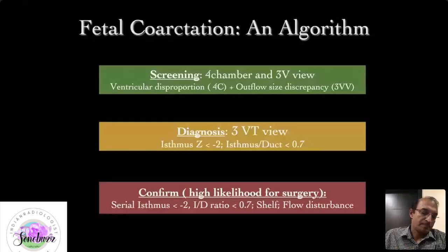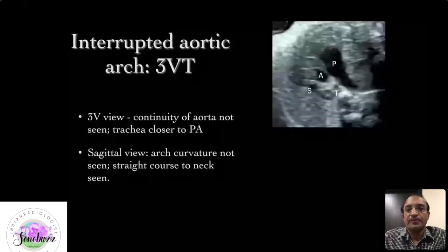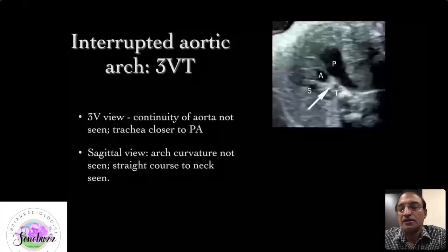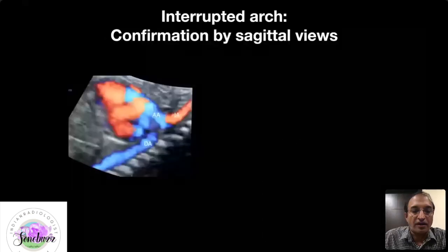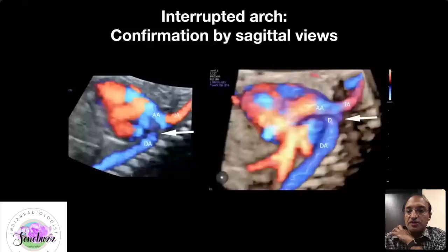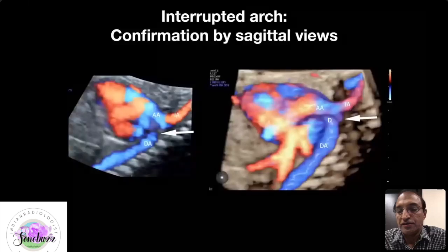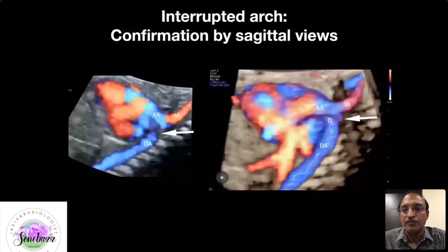If the isthmus becomes smaller and smaller with a shelf, as shown in the sagittal view, it becomes a confirmatory diagnosis. The elder brother of aortic coarctation is interrupted aortic arch, where only the PA and the ductal arch continue down. The ascending aorta just continues into the head and neck as the innominate artery. In the sagittal view you see the complete interruption — the ascending aorta is completely stopping after the innominate artery.